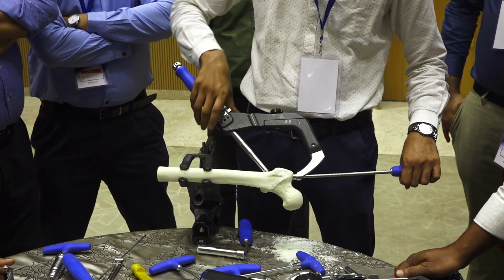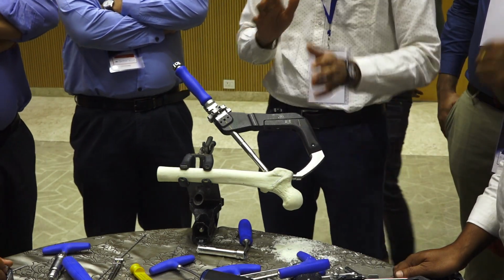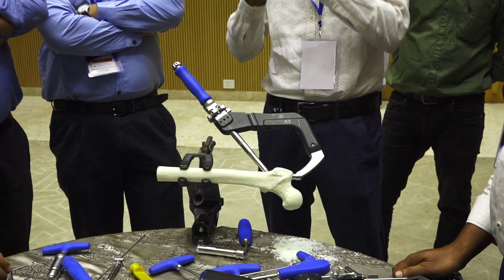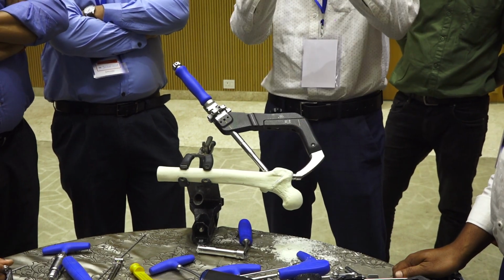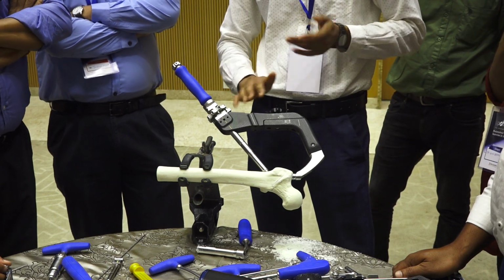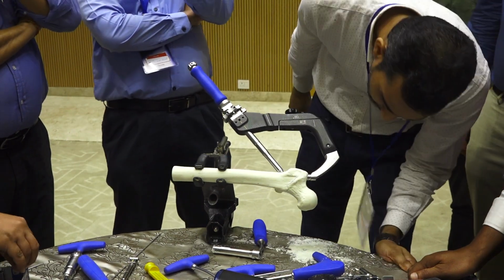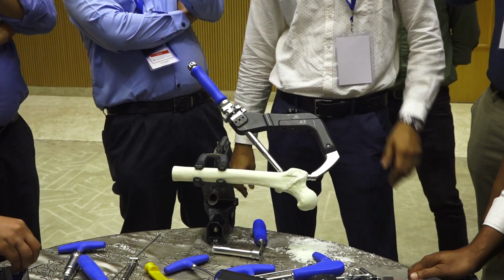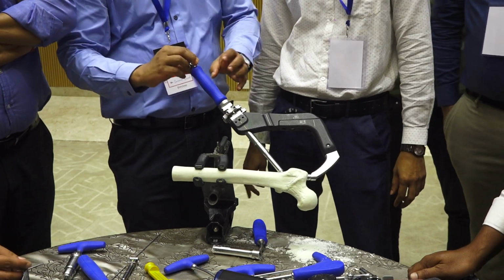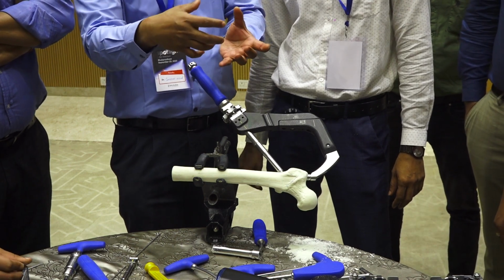What will happen if you over compress? If it is a very osteoporotic bone and you are over compressing, there is a high chance that the helical blade will loosen up. The cut out will say the helical blade will loosen. It will back out. So beyond one level, if you tighten it too much, the blade will back out. If it is a very osteoporotic bone, don't over compress. You will have that subjective feeling of how much compression. Actually, check with C-arm all the time how much you are compressing.